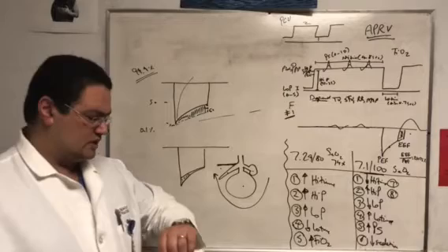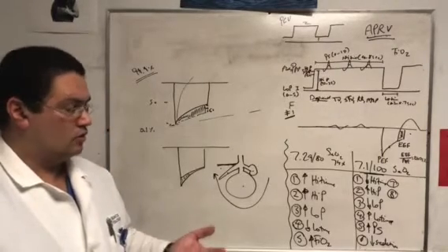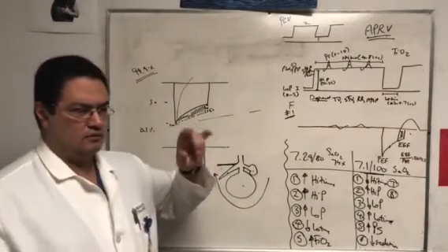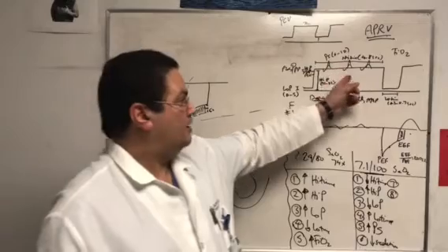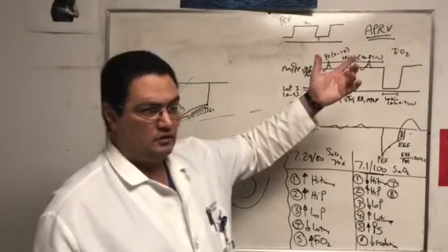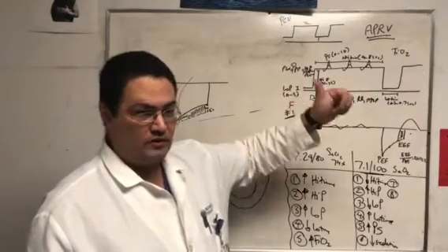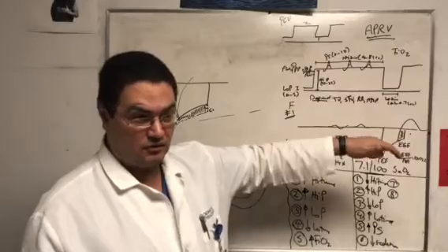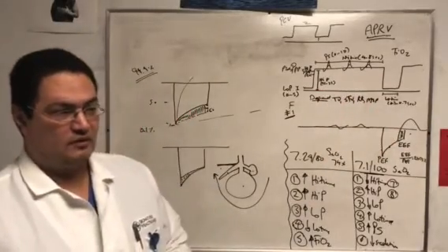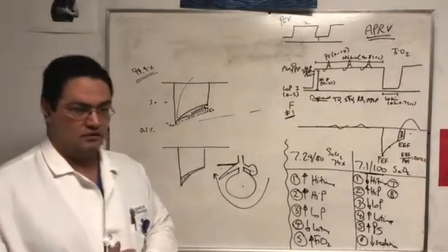So the rule of thumb when we tell the nurses how to sedate patients with APRV or BILEVEL is, look at the vitals and everything, but in addition to that, you have to have at least one yellow bleb on the high time. Yellow bleb meaning spontaneous breath. If you don't see a spontaneous breath, that means 2 things: either you're over-sedating the patient or over-ventilating the patient. The patient doesn't want to breathe. So you're going to have to give me that one bleb. But if I'm in trouble, I'll make that one bleb 3, 4, 5 by decreasing the sedation.